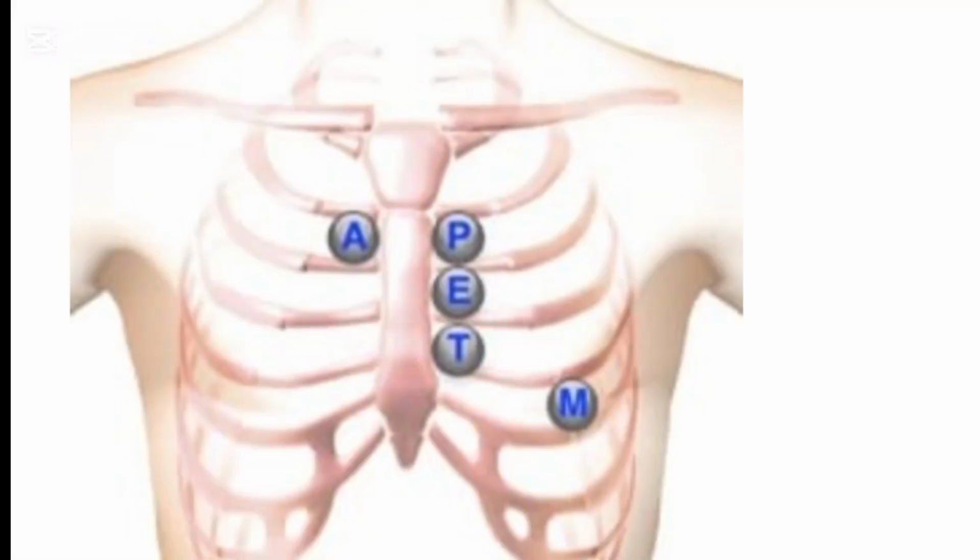So in today's video, we're going to look at how to locate the site for listening to the heart sound. And we're going to look at the normal heart sound and the abnormal heart sound. So we have the S1 heart sound and the S2 heart sound.